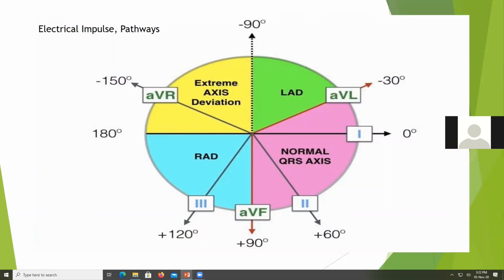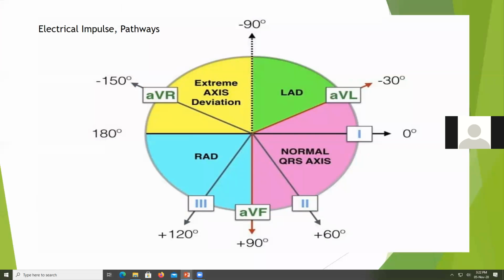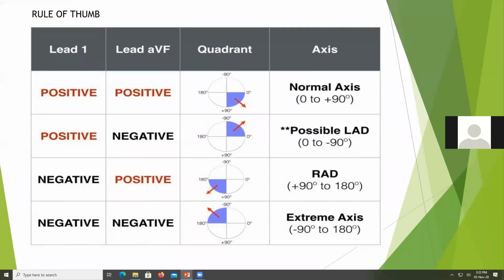Okay. This is the hexaxial system again. The one I explained to you earlier is the manual measuring of the axis, like we measure how many small squares and identifying the AVF and the lead one. But here, this is the rule of thumb in identifying the axis. Again, we have to identify the lead one and the lead AVF, and just determine whether the amplitude of the QRS complex is positive or negative.